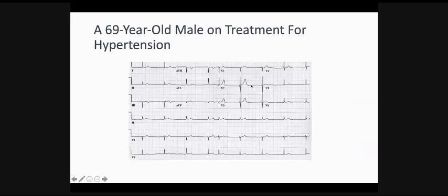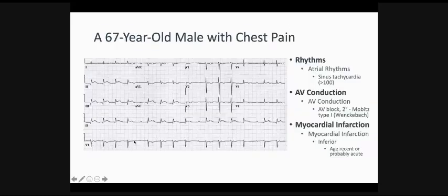So the thing, let's go back. The thing that I want to concentrate on for the boards is that if you face any patient with an ECG that is consistent with an inferior myocardial infarction, there are a few things that you should keep in mind in that regard. The first is if there is a posterior extension or an RV infarction that is associated with an inferior ST elevation myocardial infarction.